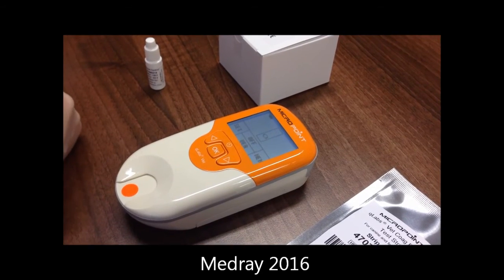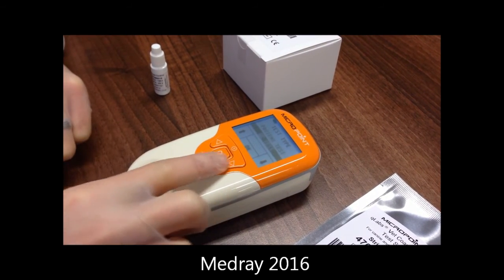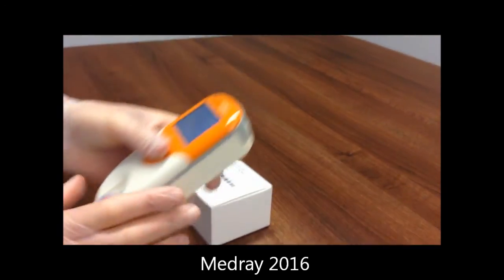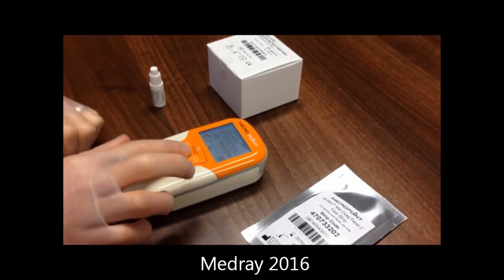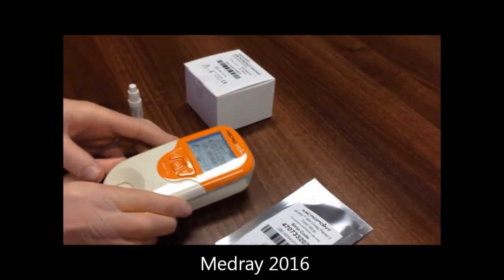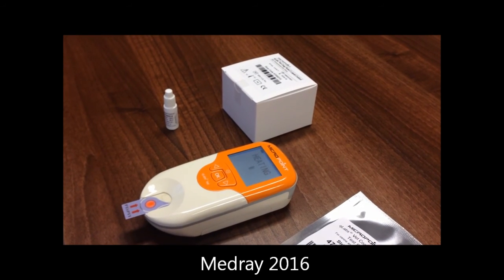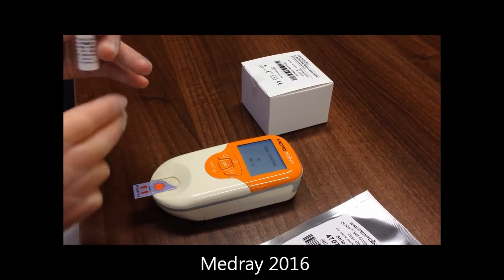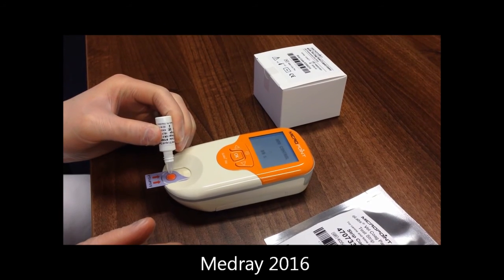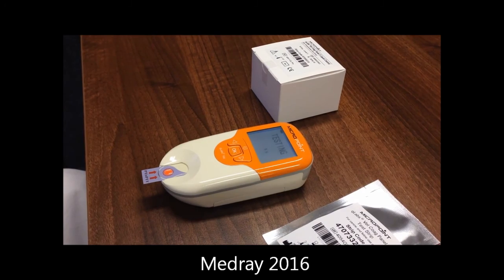To run quality control material, switch the analyzer on, insert a strip, and press the down arrow and OK to select QC test. Ensure the code matches the code on the pouch. Run the QC as you would a normal sample, ensuring you swirl the QC gently 10 times prior to running it. Apply one drop of QC to the test strip. Results will be displayed in around 7 minutes and should be compared to the ranges printed on the QC vial.